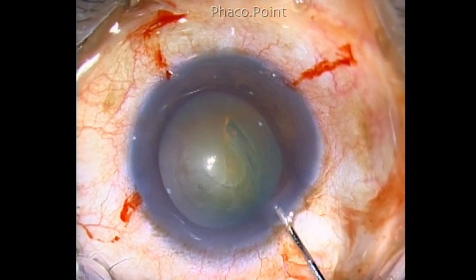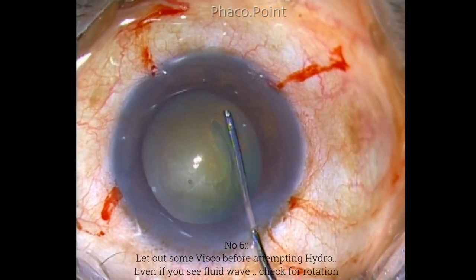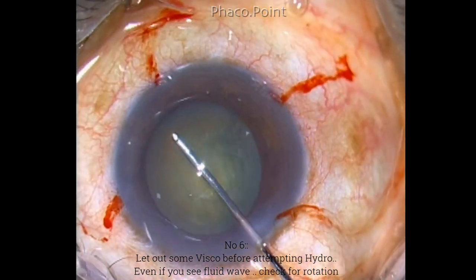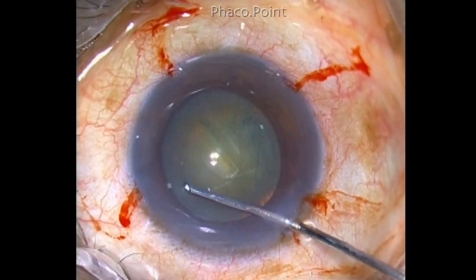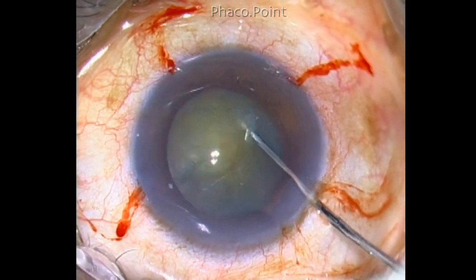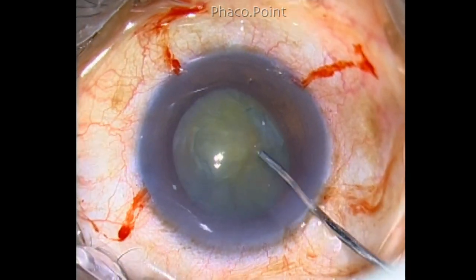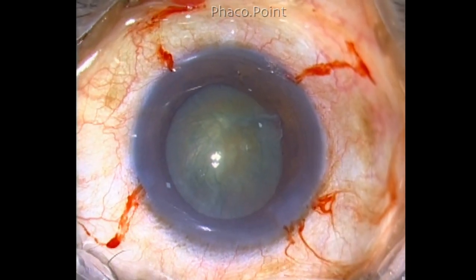Before performing hydrodissection, always depress and let out some visco, then take the beveled cannula underneath the capsulorhexis edge, tent up the capsulorhexis, and then inject small aliquots of fluid. Even though you saw the nucleus rising and sometimes even a fluid wave, always ensure nucleus rotation before proceeding.